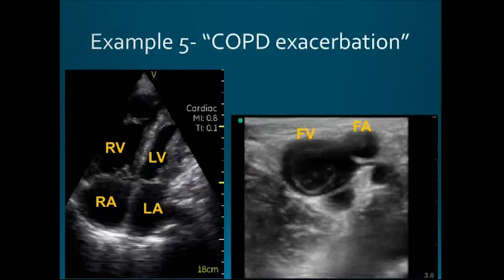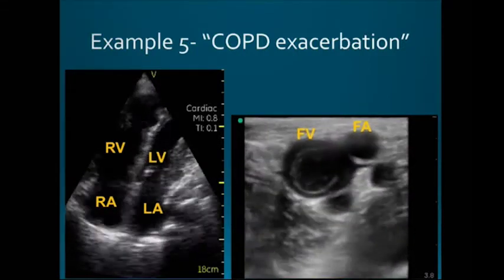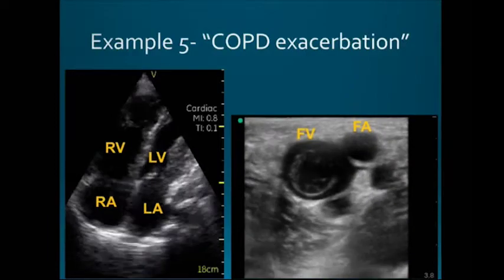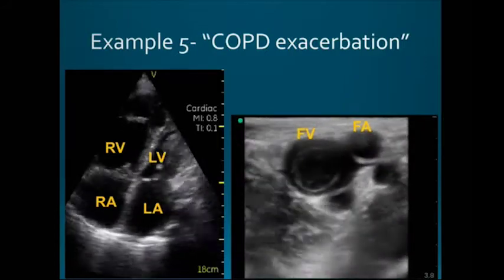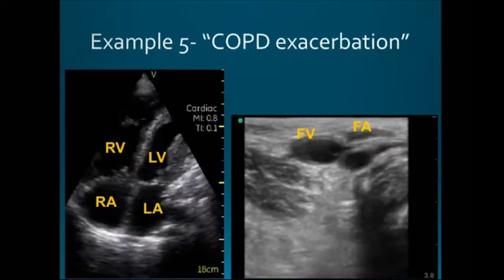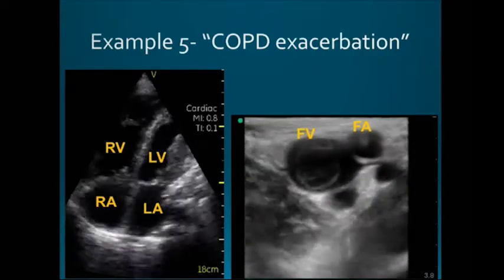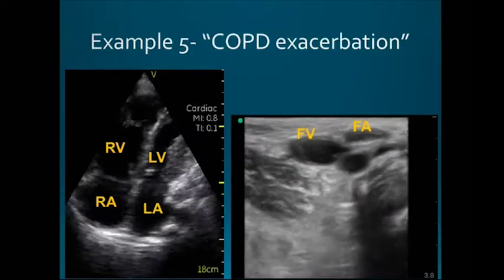And here, this is an apical 4-chamber view, so you can see 4 different chambers of the heart. This is his left side here, left ventricle, left atrium. This is his right side, right ventricle, right atrium, tricuspid valve, mitral valve. And normally, the left side should be much bigger than the right side. But here, what do you guys think about the right-hand side compared to the left-hand side? Do you think the right side's bigger? Looks bigger, right? You don't need to be an echocardiographer for this. You don't need to be a cardiologist. This side's clearly bigger than the other side. And he has no history of pulmonary hypertension, no history of any of that stuff.